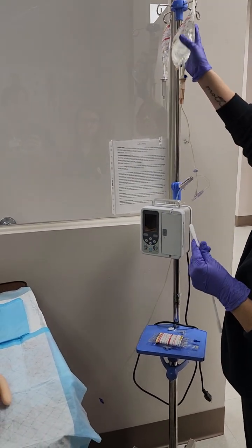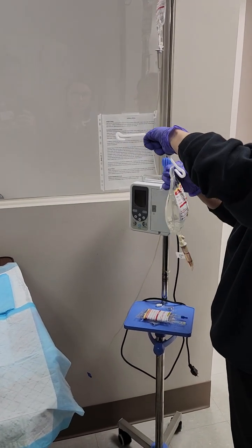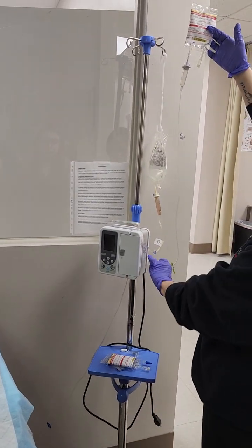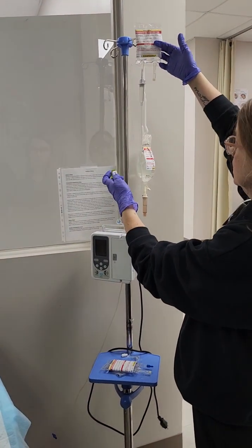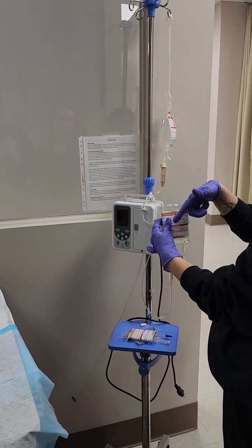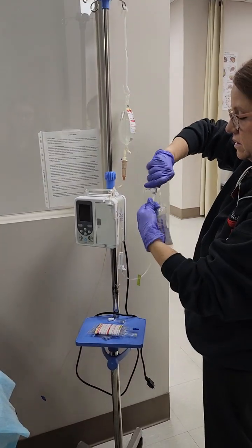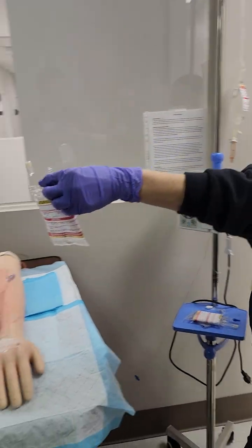Primary always hangs lower. So I'm going to take my hook that comes in my secondary tubing package and put it through, drop this one, okay? Now I'm going to take this down, but what I have to make sure I do is clamp this, okay? This is open, and I want to clamp it, because when I pull this down, see how all of this starts backflowing into this? So this has got to be clamped. That way when I pull it down, it doesn't backflow. So I'm going to take this out. I want to make sure my spike stays sterile.